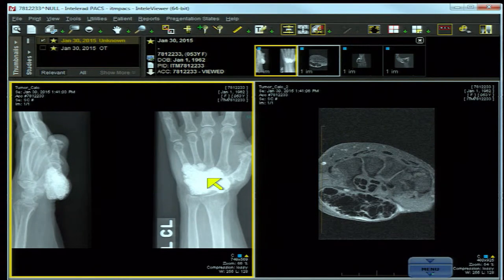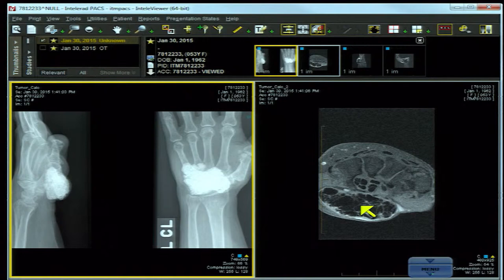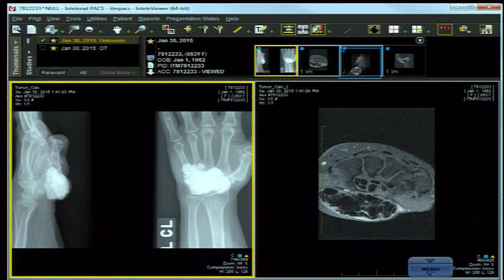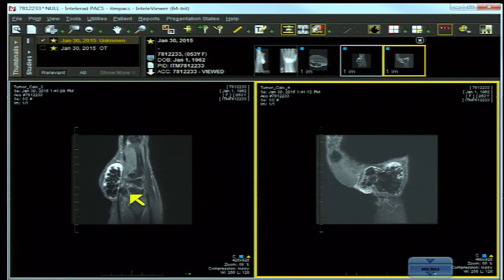The radiograph from this patient shows dense, intense calcification in the palm of the hand. On the axial short-axis T2-weighted MR, there are foci of hypo-intensity, bulky and mass-like, surrounded by high signal intensity, which is perhaps a little more easily seen in the sagittal or lateral projection and also visible in the coronal projection. This surrounding high signal area represents an adventitial bursal reaction to the mass.